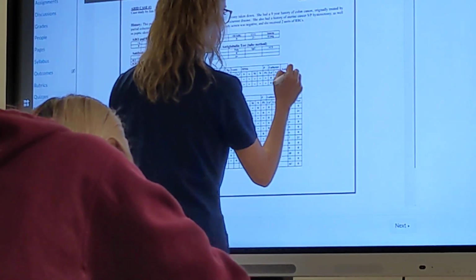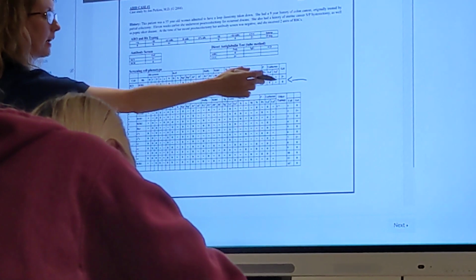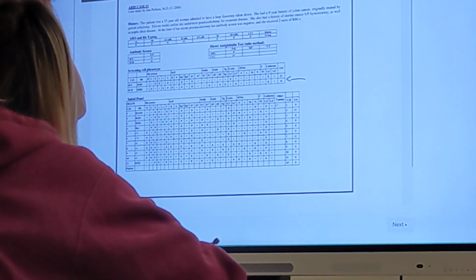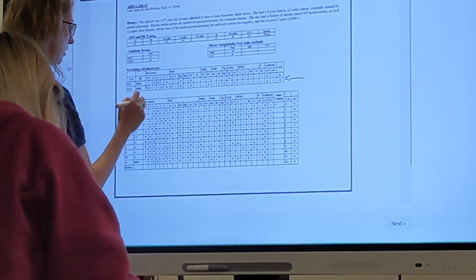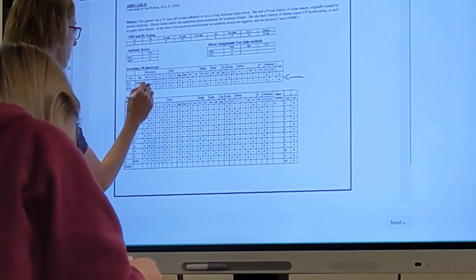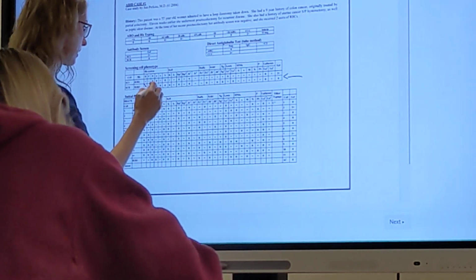Didn't get reactivity. So my patient's antibodies didn't react with the antigens that are present on this line. And so I'm going to go through and mark out the ones that are homozygous, which is so hard to see. So big E and little c are homozygous.